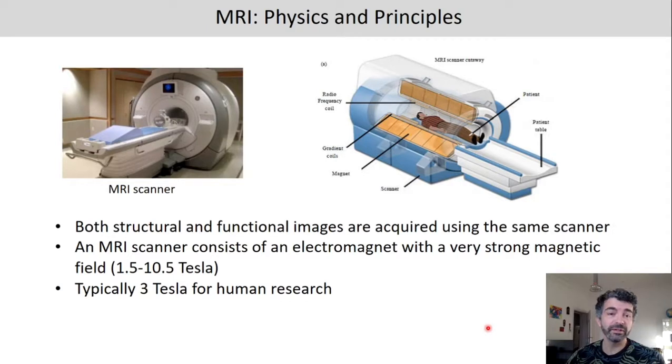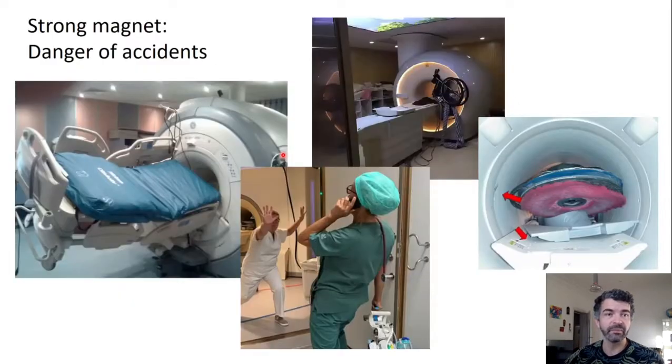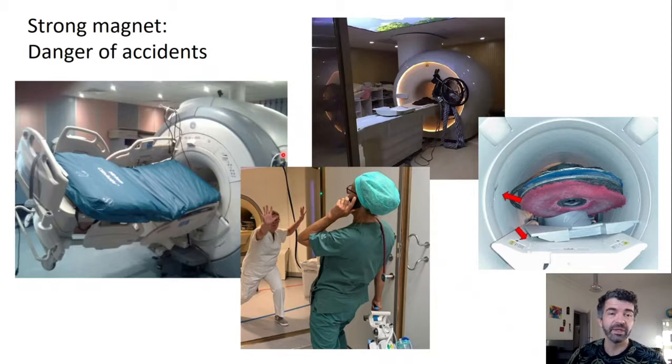Both structural and functional images are acquired using the same scanner. Here you can see an MRI scanner and this is a schematic. Here this is the magnet. This electromagnet can apply very strong magnetic field up to 10.5 tesla although 3 tesla is probably the most common scanner for cognitive neuroscience research. Because we have such a strong magnet there's also a severe danger of accidents. Here you can see a hospital bed that doesn't even touch the ground because it is so strongly attracted by the scanner.